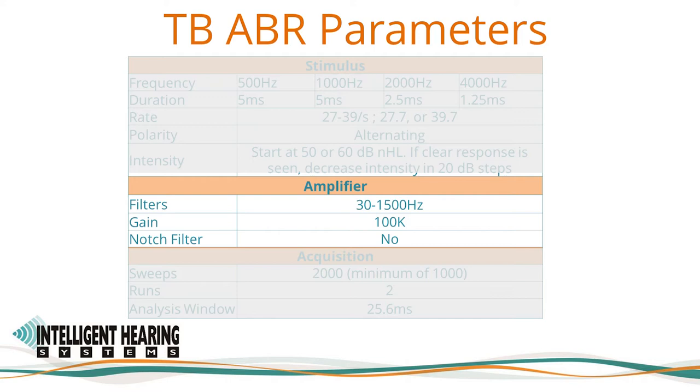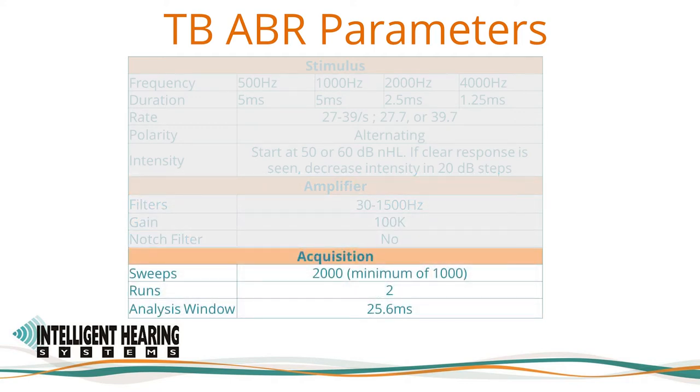The low-pass filter is set to 1500 Hz. The amplifier gain is set to 100,000 amplification. The notch filter — 60 or 50 Hz depending on where you're located — is turned off, but can be activated to reduce line noise when needed. Sweeps are the sample size or number of repetitions. The more you average, the more likely you will eliminate noise and increase response clarity. Commonly used sweep counts include 1024 and 2048 for ABR. The Academy guidelines state that the protocol should be set by default to at least 6000 sweeps and stopped manually when a clear response is detected. Reliability can be evaluated by repeating an average at least once or by the use of valid response detection criteria such as the FSP.